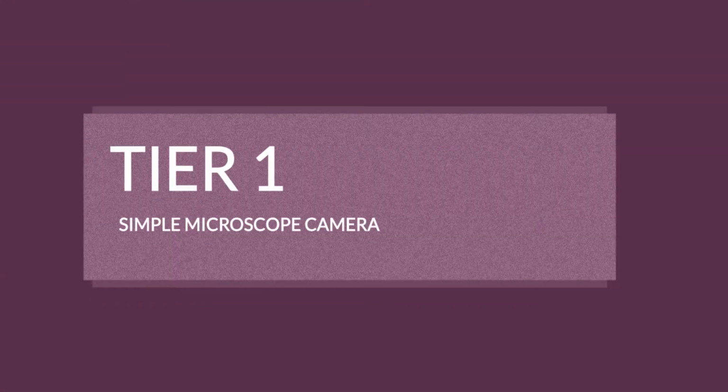Tier 1. Simple microscope camera. Simplest form, it's just a camera connected to your microscope, some good imaging software, being able to adjust the image and capture it. And there you have an image. So that would be the basic option, camera and a microscope.